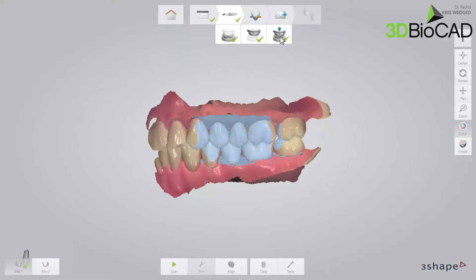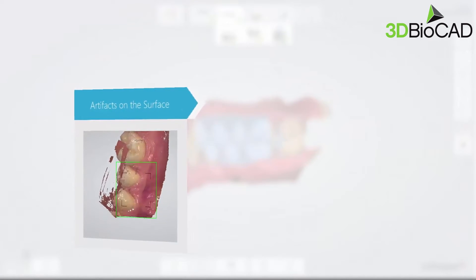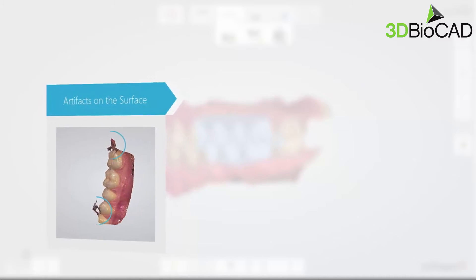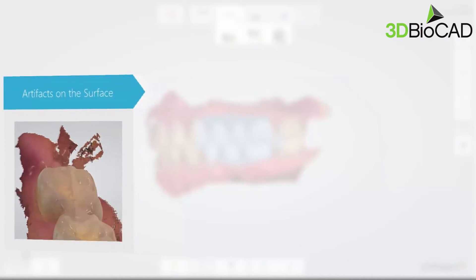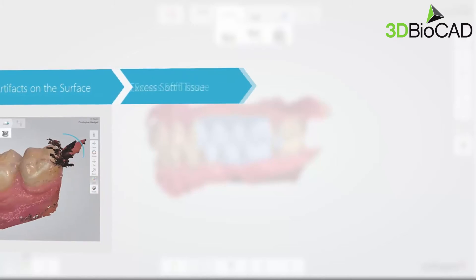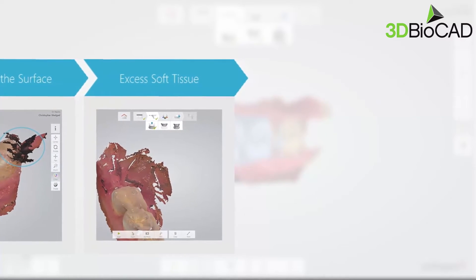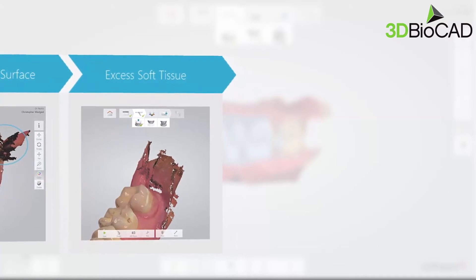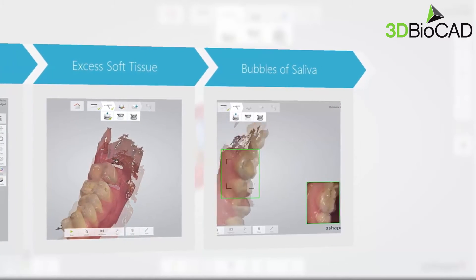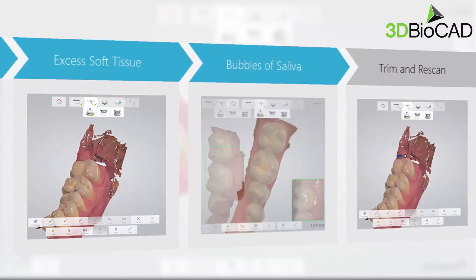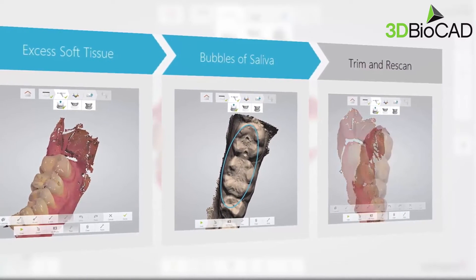When scanning the arches, there are a few things that will help you obtain the correct bite. First, avoid artifacts on the molar surface — these may result from soft tissue being scanned onto the teeth. Retract soft tissue from the teeth while scanning using, for example, a dental mirror. Second, avoid excess soft tissue at the back, distal of the last molars or large portions of sulcus to the cheek. Third, avoid bubbles of saliva being scanned onto the occlusal surface — dry the teeth before scanning. If you accidentally scan one or more of the mentioned artifacts on the teeth, simply trim away the artifact and re-scan that area.